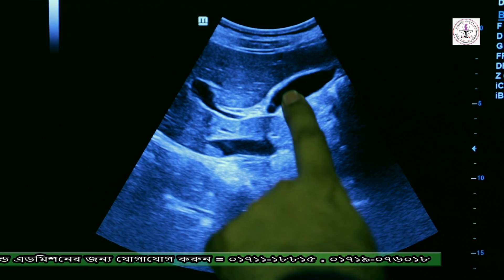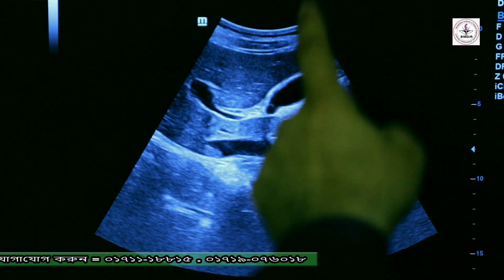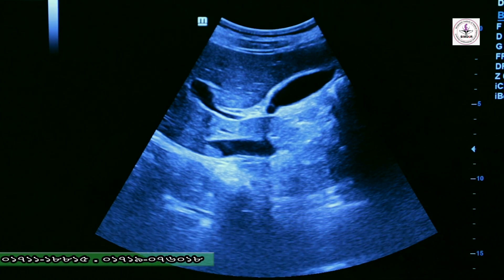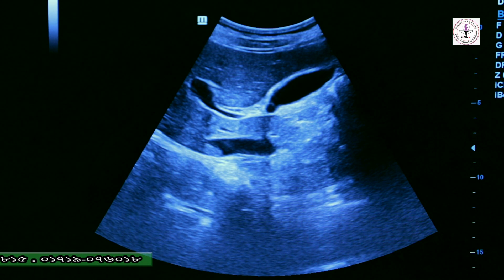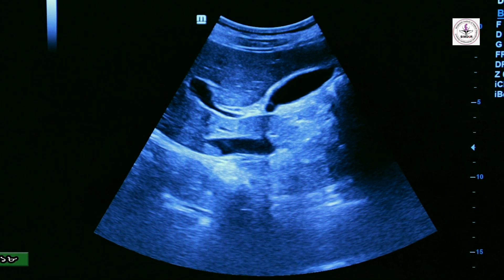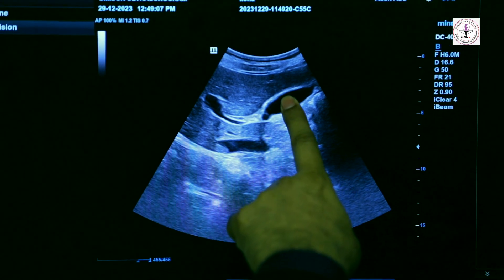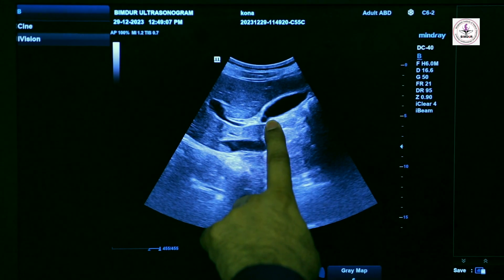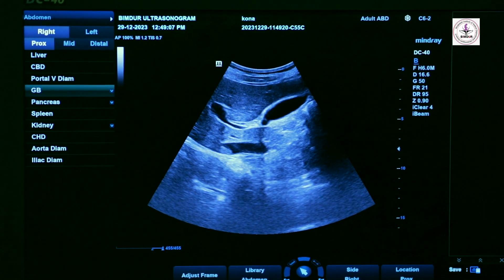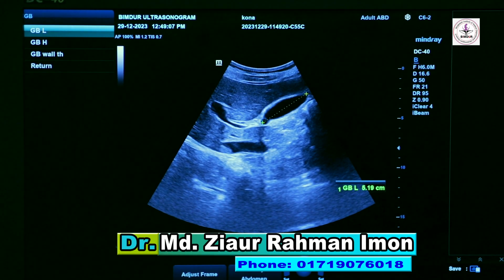Like an echogenic structure — this is the criteria for gallstone. When we see a normal gallbladder, at that time we see the fundus, neck, body, anterior wall, and posterior wall. This is the gallbladder measurement — from fundus to neck is the length of the gallbladder.